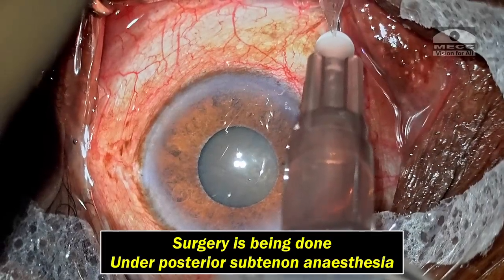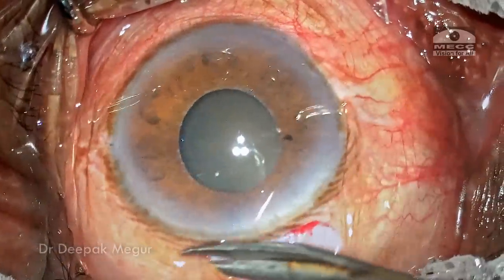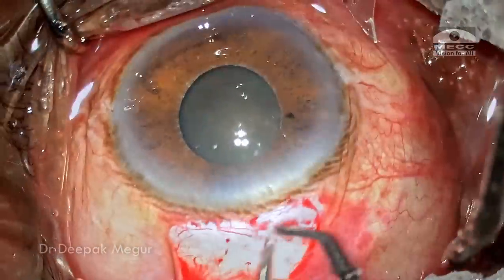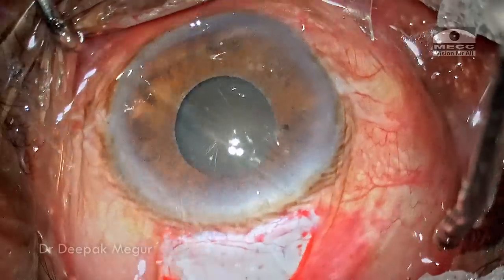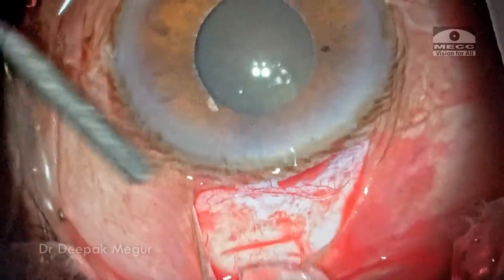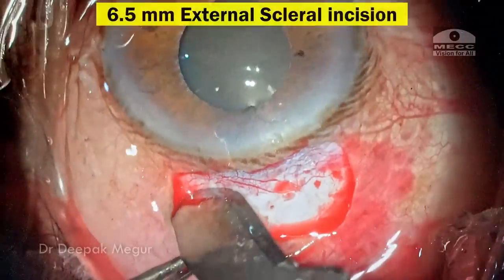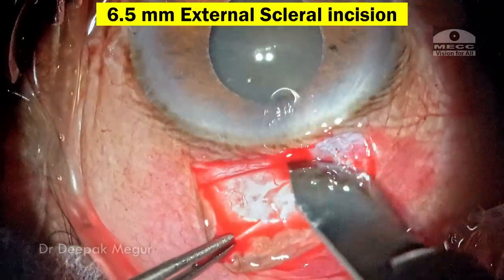The surgery is being done under posterior sub-tenon's anesthesia. The conjunctival flap is raised and bleeding episcleral vessels are cauterized. A small posterior scleral groove is created, which is used primarily for fixating the globe while creating the tunnel. A 6.5 mm external scleral incision is made.